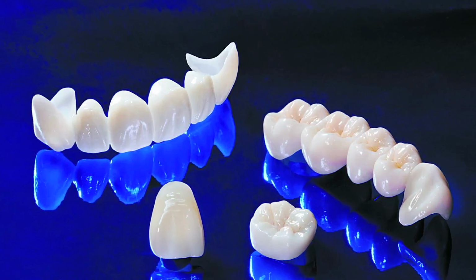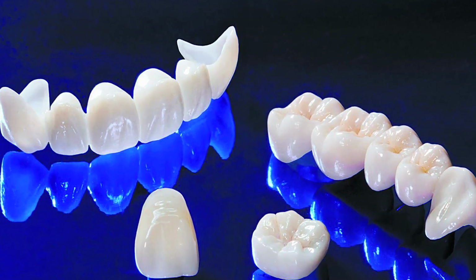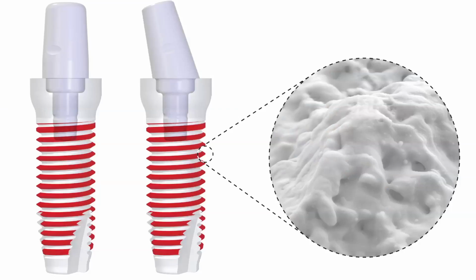Zirconium oxide is derived from metal zirconium, but it has lost all the metal properties due to the chemical reaction. Metals are characterized by certain characteristics and properties like electrothermal conductivity and free electrons, but the ceramic material, as a consequence of the chemical reaction, does show a completely new set of characteristics. It does not show any of the characteristics of the original materials. Not all zirconia materials are the same. Their characteristics and strengths very much depend on the way they are processed.